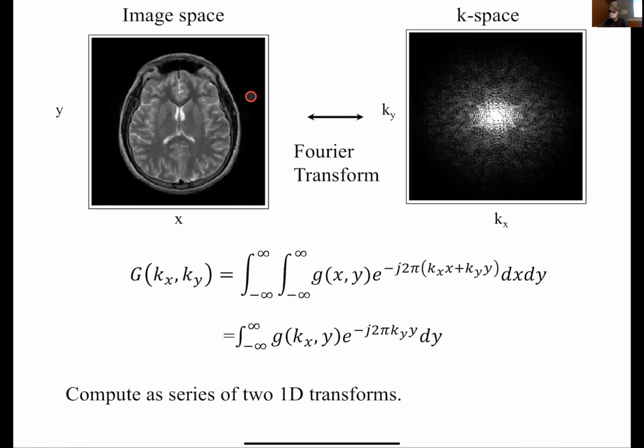Okay, just to remind you that throughout this whole course, we've been talking about going between image space and Fourier space, because we collect the data in Fourier space, or K space. The reason we do that is that we're able to manipulate the phase of the spins, right? And that allows us to do the Fourier transform in a very straightforward fashion.